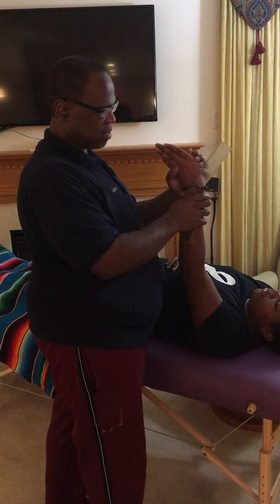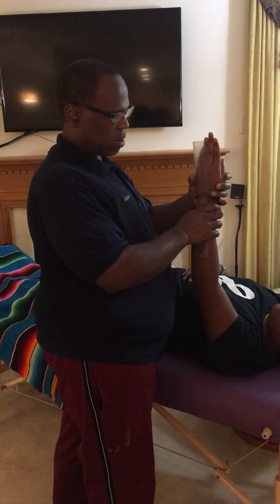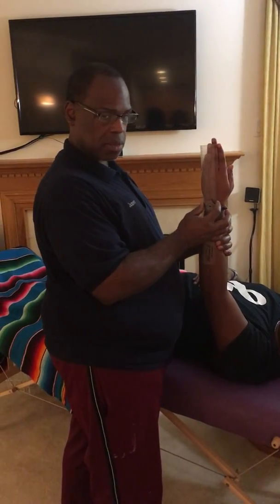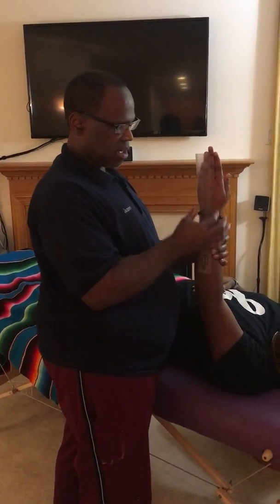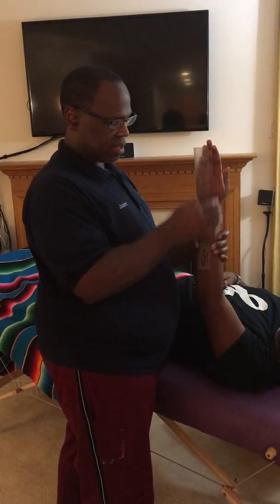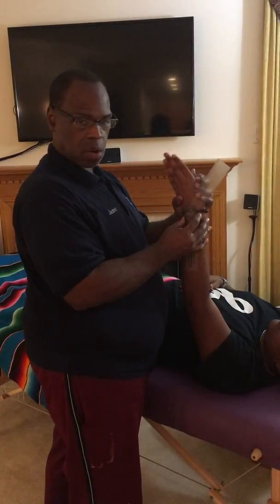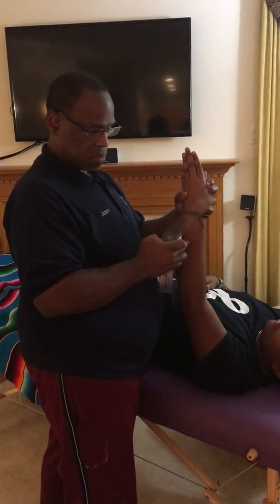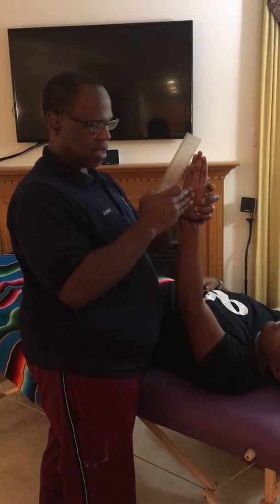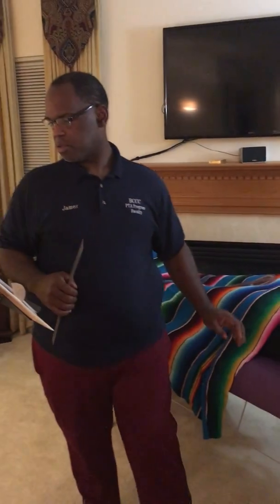If the wrist moves this way, the goniometer will follow. But again, in order for us to read correctly, the neutral position for this particular motion and the others that are listed there is with the goniometer in the 180-degree position, and it will follow along with the body part. This will be the stationary arm, here will be the axis, here will be the movable arm. All right, that is number 3.